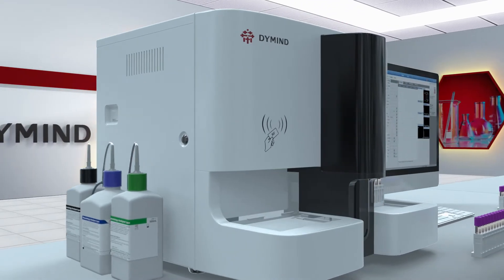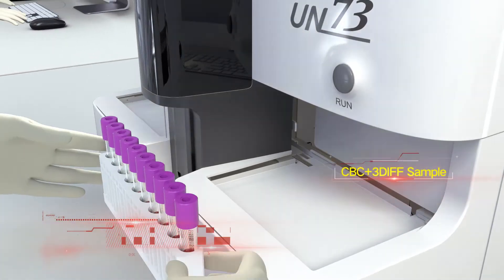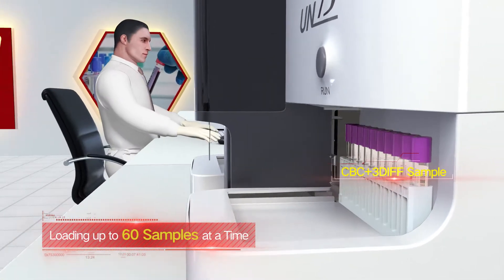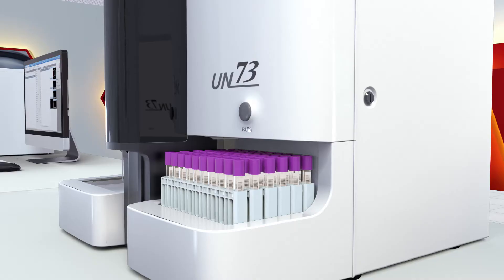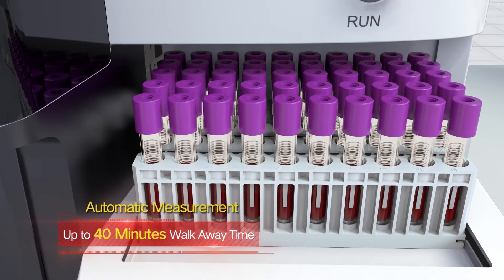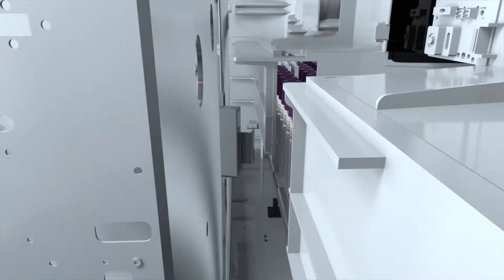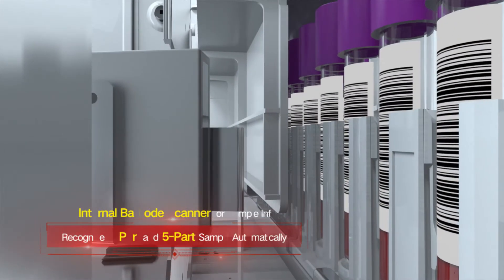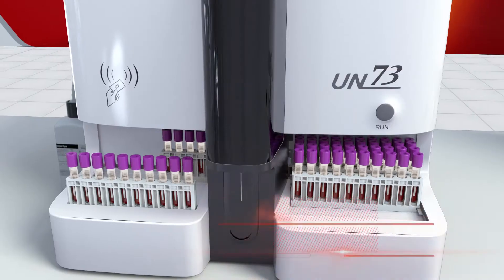The working list function helps users input sample info in advance. 60 samples can be loaded at a time, and three-part and five-part samples can be measured on one rack. One button enables automatic measurement, with 40-minute walk-away time available for users. A built-in barcode scanner acquires sample info and recognizes three-part and five-part samples automatically.